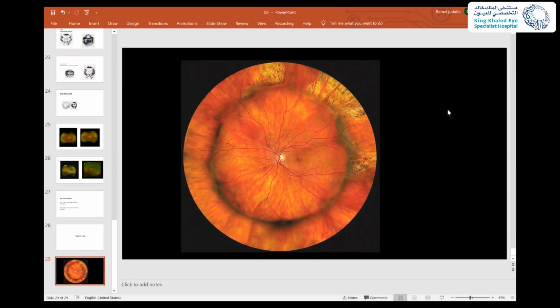Absolutely. I, on the other hand, prefer doing them with the spotlights. You have to move your hands around the field in order to be able to address each of the different quadrants. And sometimes with a microscope, I feel like I have a limitation to all that movement. But that's just me.